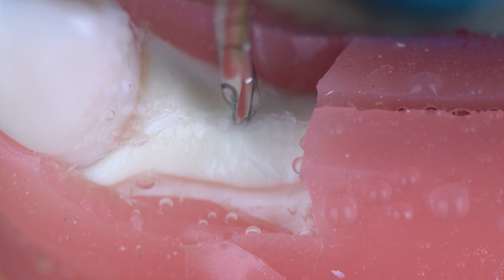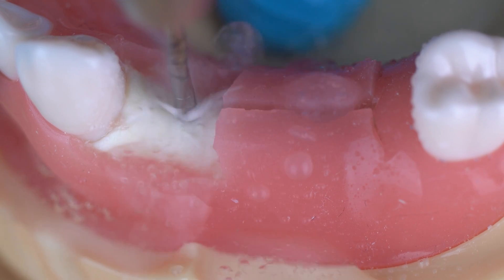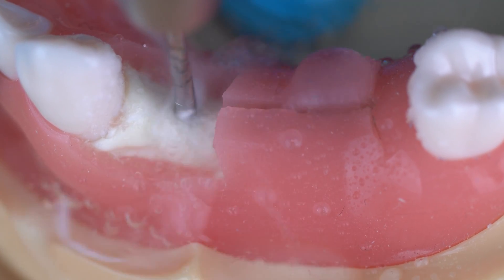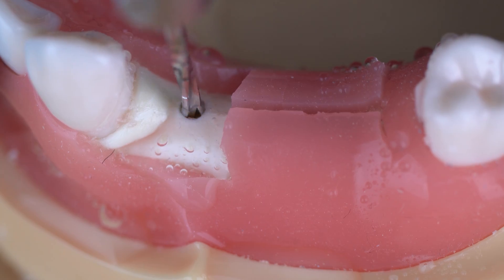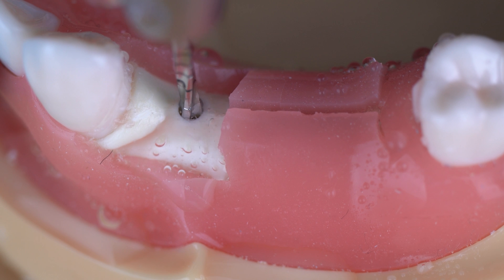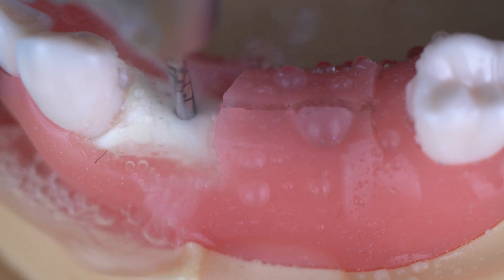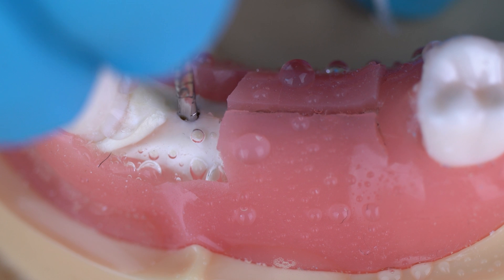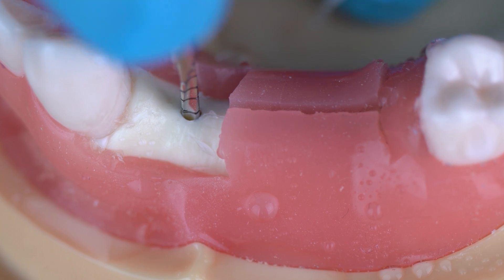Apply a little bit of pressure and make a small dimple right at the midpoint. Then run the drill before contacting bone and use an up-and-down motion, taking this to about six millimeters or so. The first line is eight millimeters, so you don't have to take it all the way down to that first line. The preparation is now almost down to that first line — almost eight millimeters.